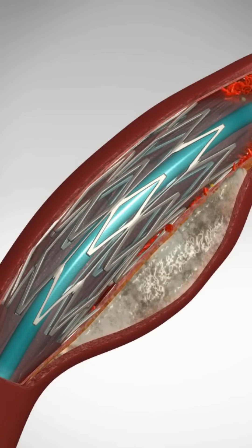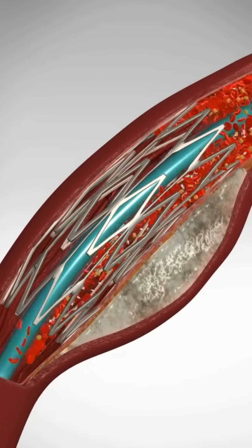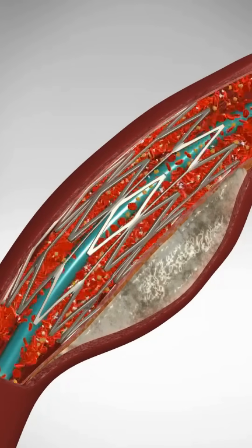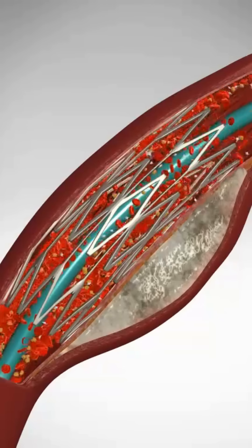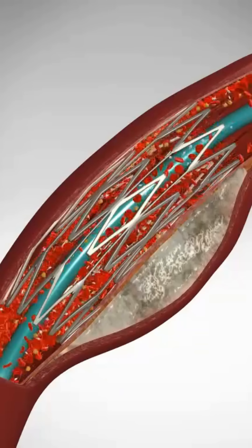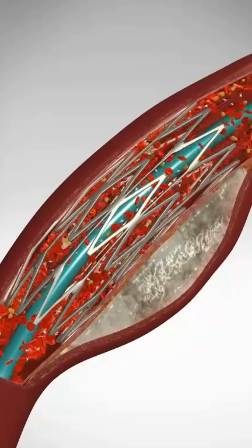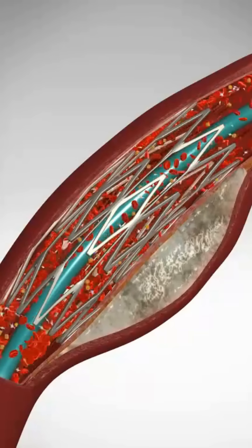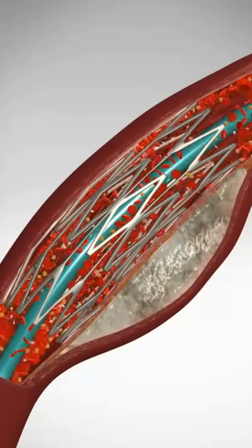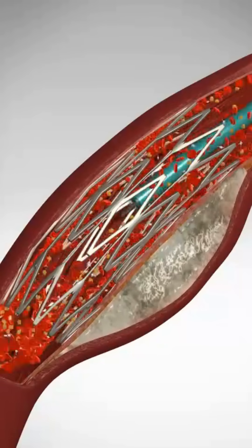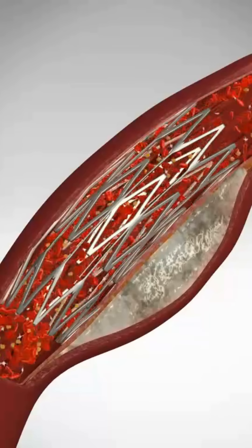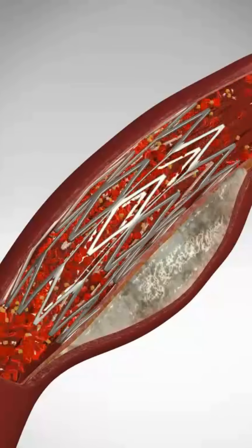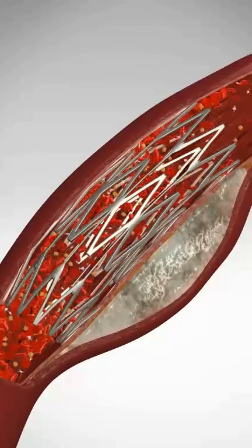Then the balloon is deflated, but notice the stent remains expanded. It's still holding the artery open. The catheter and balloon are pulled out of the artery and out of the body, but the stent remains in place inside the artery, keeping it open.